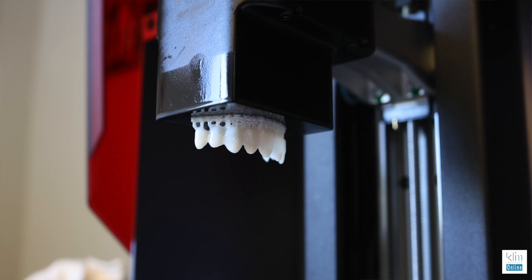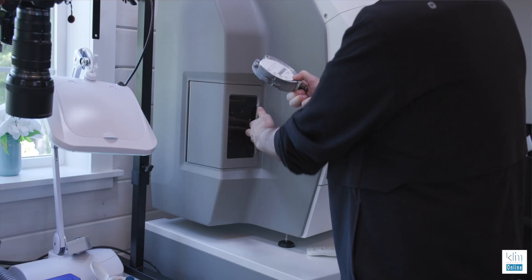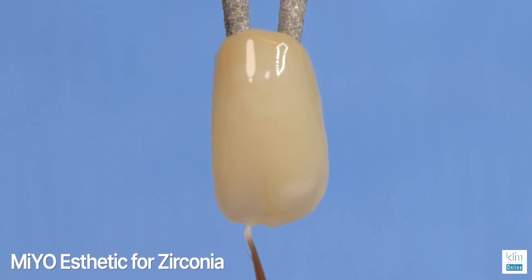Now, when I'm working on larger cases and I'm doing more of a lab approach — so I'm not delivering those in the same day — I'm printing the provisionals, and then up here at my digital studio I'm using the PM7, and I'm processing those restorations here at my lab bench. I'm using Mio 850 and Mio Aesthetic based on what I need, whether it's lithium disilicate or zirconia.